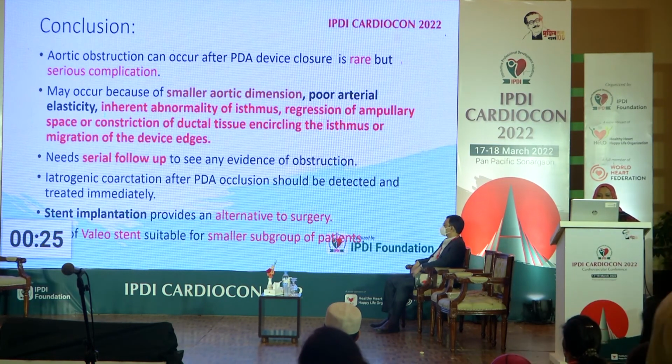Stent implantation provides an alternative option to surgery, and use of Valeo stent is suitable for such a subgroup of patients.